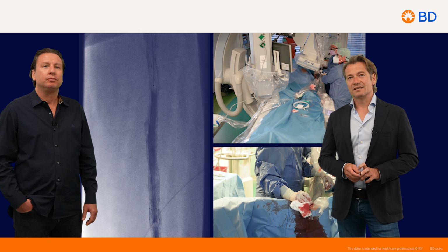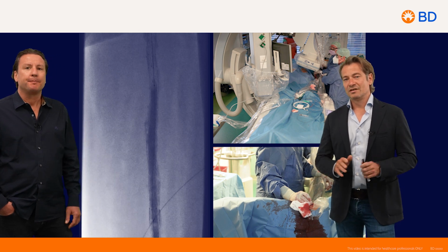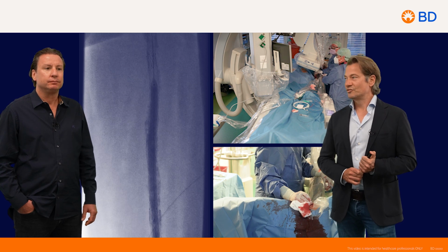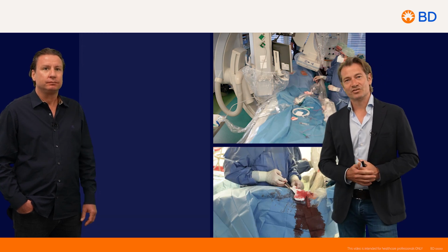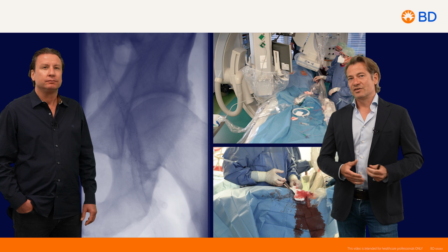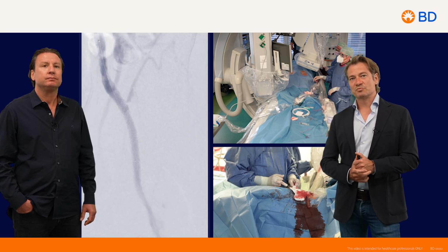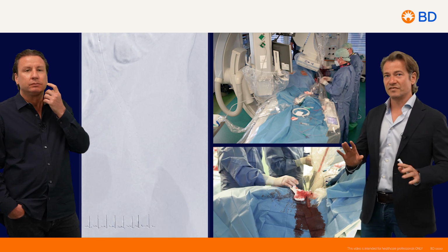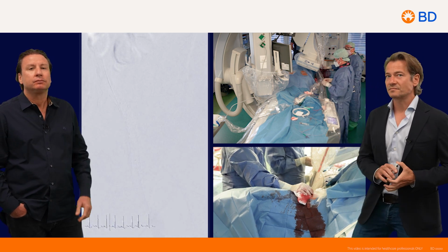In this case you would like to end up with a perfect result, so that you don't have to go in again in a short time span, because there are so many stents and so many punctures over the years. It's always good to fix everything in such a case.